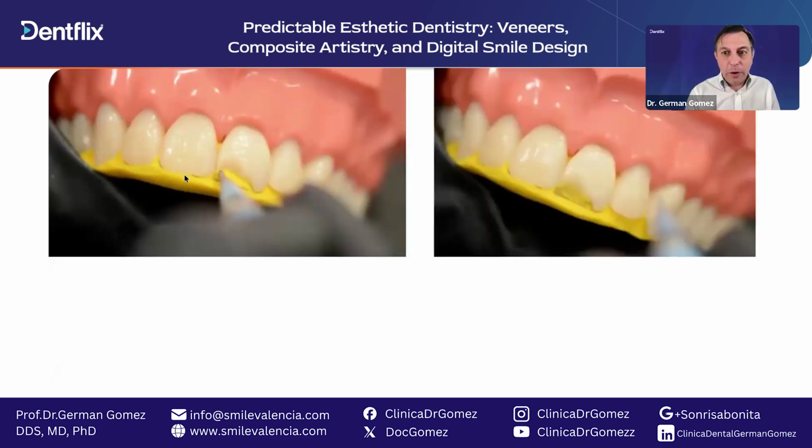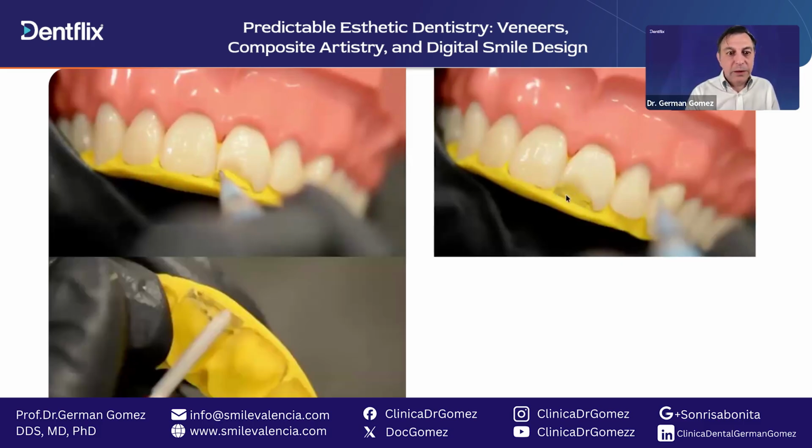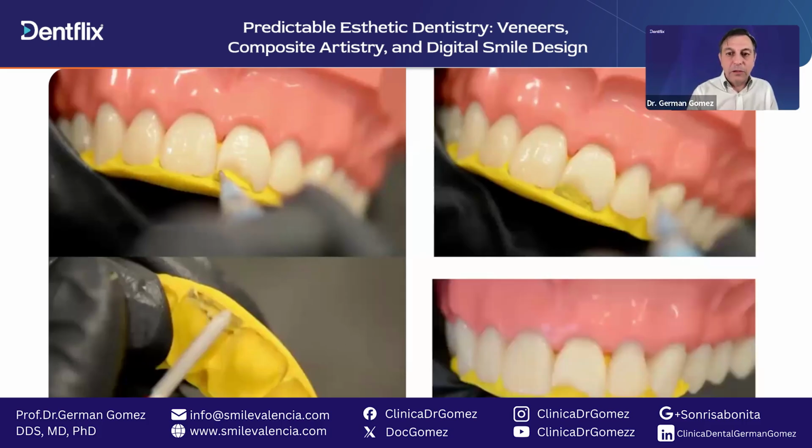Then we take a burr, so we then paint the whole thing that we have to take away. Then we take a burr and we take that away so that it is on the same level as the other tooth or the rest of the tooth. Okay, and then we can start making the layers from the back to the front.